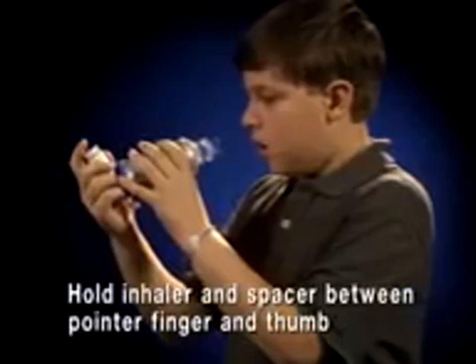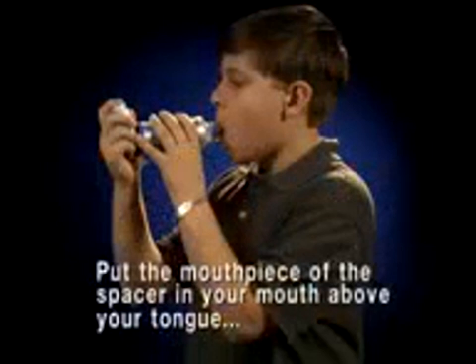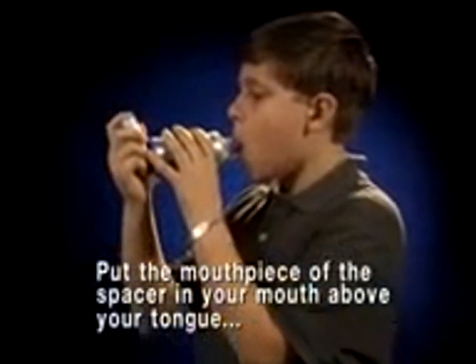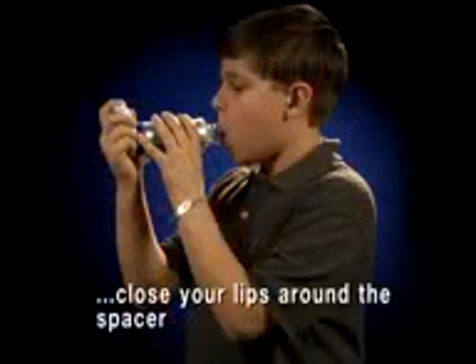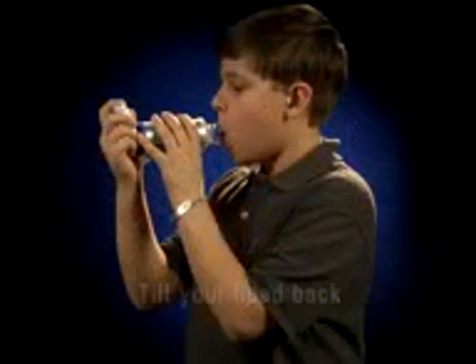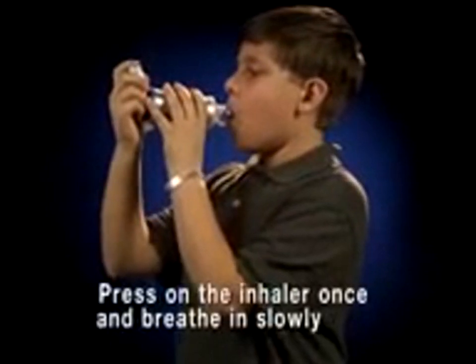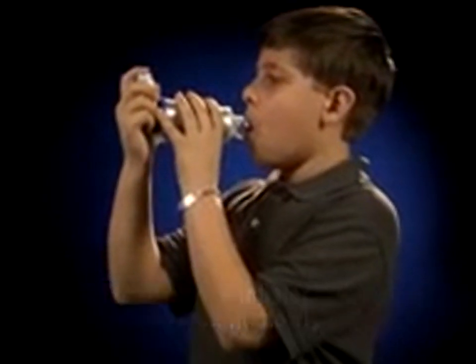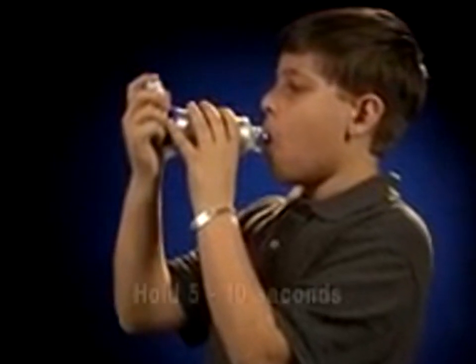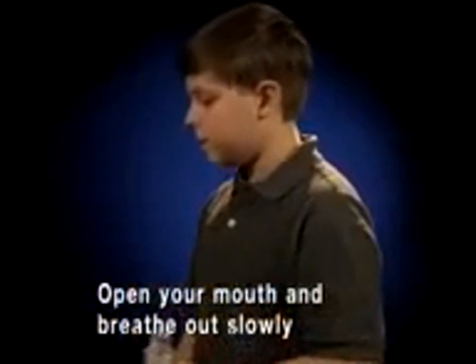Hold the inhaler and spacer between your pointer finger and thumb. Put the mouthpiece of the spacer in your mouth and above your tongue. Close your lips around the spacer. Tilt your head back a little bit. Press down on the inhaler one time and breathe in slowly and deeply. Breathe in all of the air you can and hold for 5 to 10 seconds. Open your mouth and breathe out slowly.